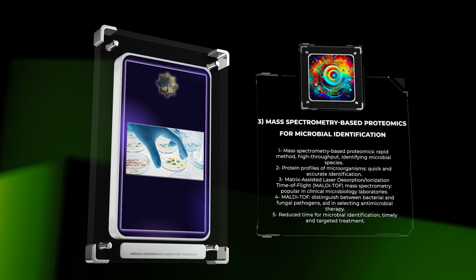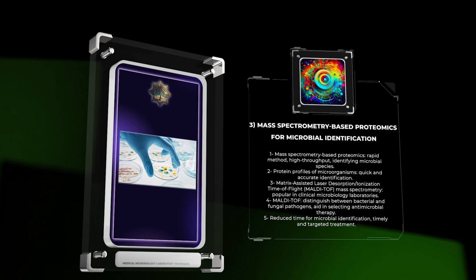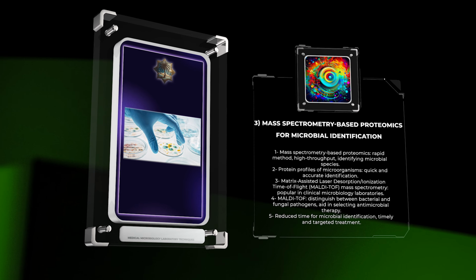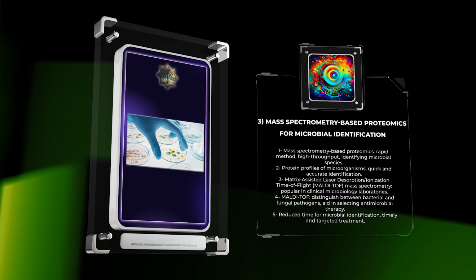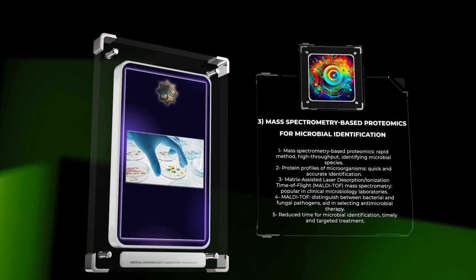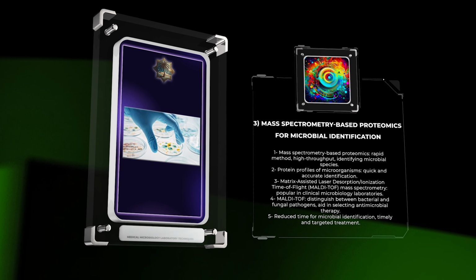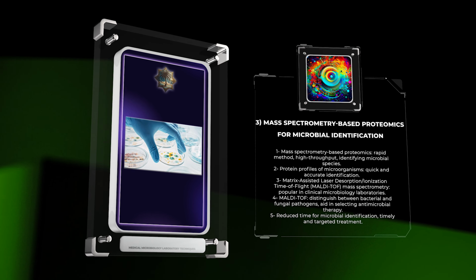Matrix-assisted laser desorption/ionization time of flight, MALDI-TOF, mass spectrometry is particularly popular in clinical microbiology laboratories. MALDI-TOF can distinguish between bacterial and fungal pathogens, aiding in the selection of appropriate antimicrobial therapy. This technique has significantly reduced the time required for microbial identification, enabling timely and targeted treatment.